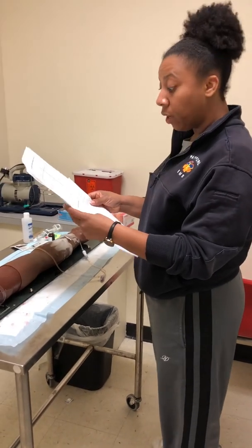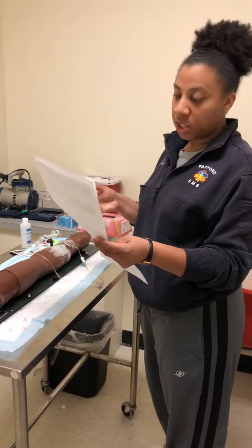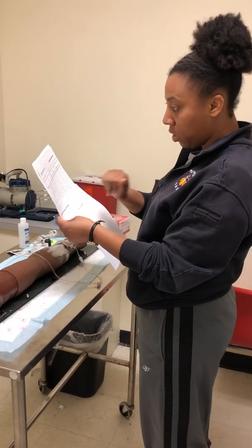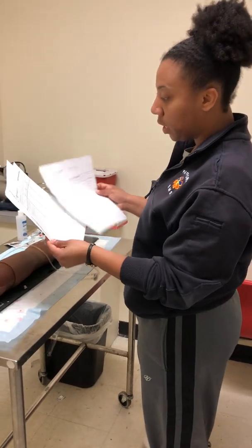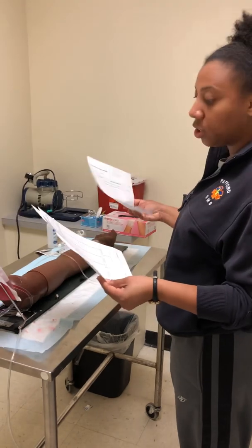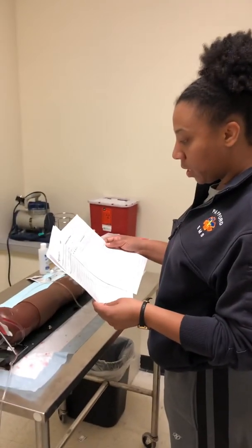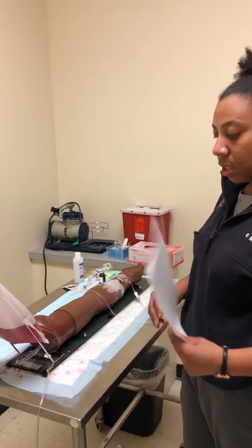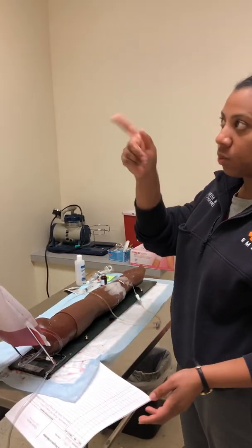She is ordered to get 40 milligrams of furosemide IV push. That's every 8 hours. And I am checking both of them to make sure that they match, and they both do match. Okay. Also, like I said, go ahead and check allergies to make sure she has no allergies to the medication. All right, once I get that done, before I do the IV push, I'm going to check the compatibility to see if she can even receive the Lasix with what she has hanging.